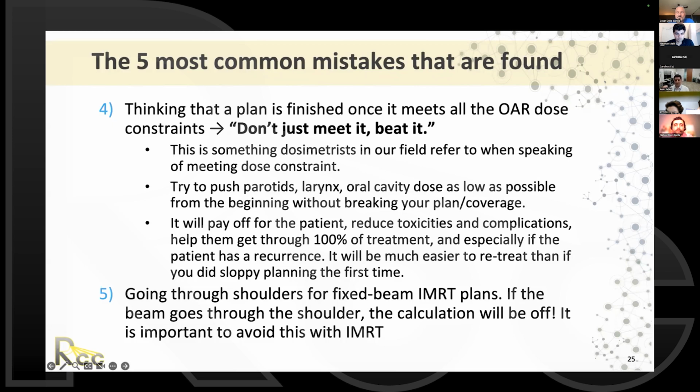Documenting the physical exam, Dr. Malik and I were both trained very meticulously to document, almost better than the surgeons, because we have to really know where this disease is going on a CT, which is all gray. The surgeon can still make judgment calls in real time. So knowing exactly, was there some mucosal abnormality going on to the pterygomandibular raphe? Was there some nodularity when you examined with your finger on the glossotonsillar sulcus or base of tongue? That can help you to make judgment calls when you're contouring. So the FILM CB CHOP gives you the most comprehensive approach for evaluating.